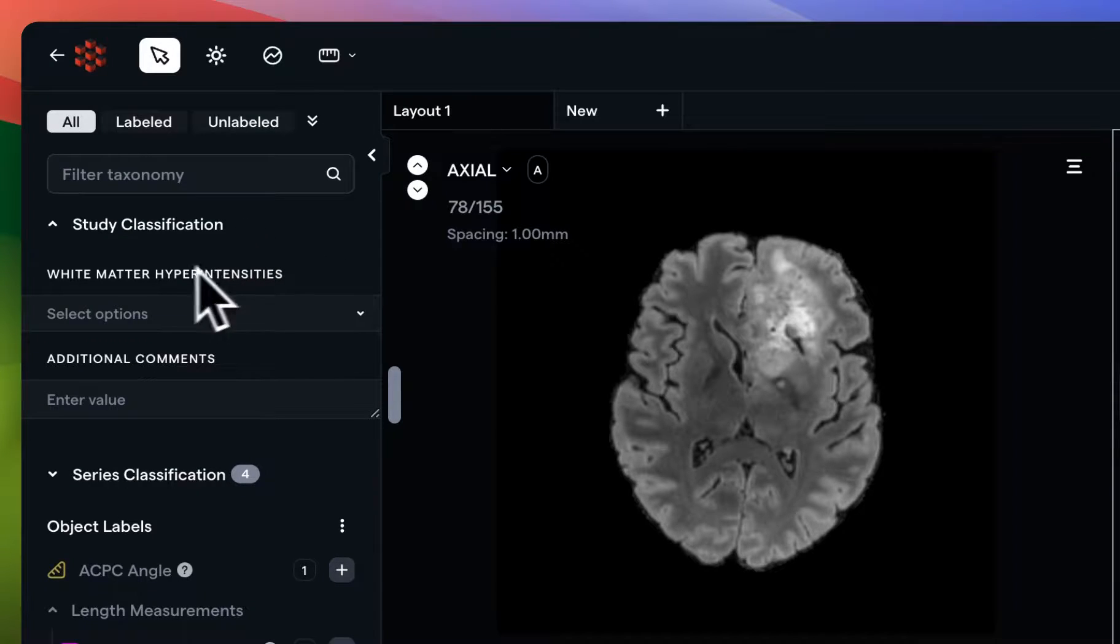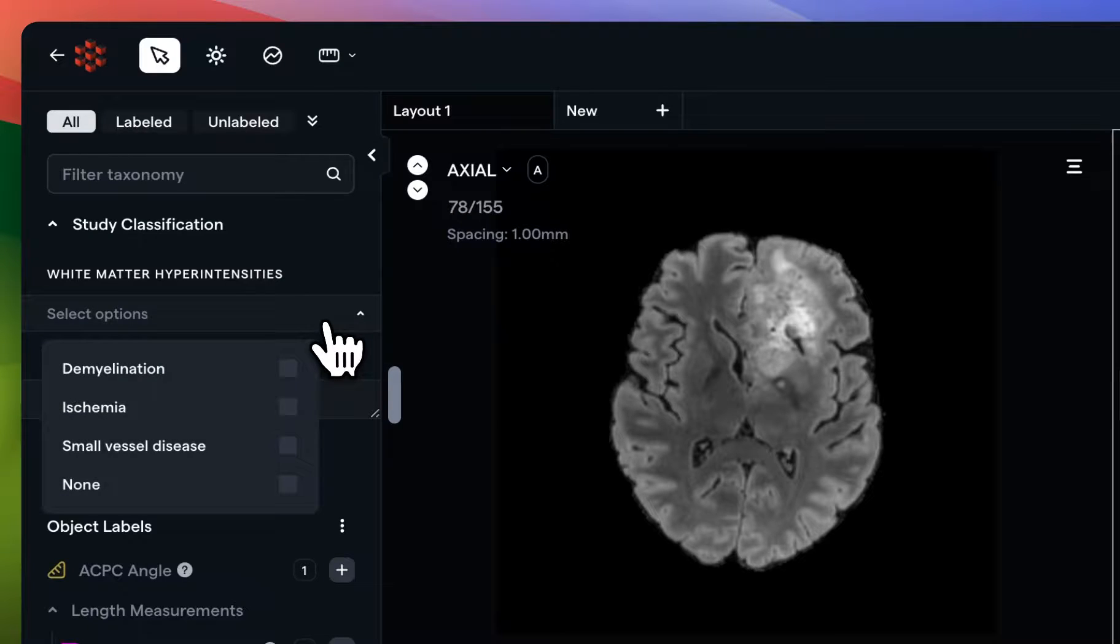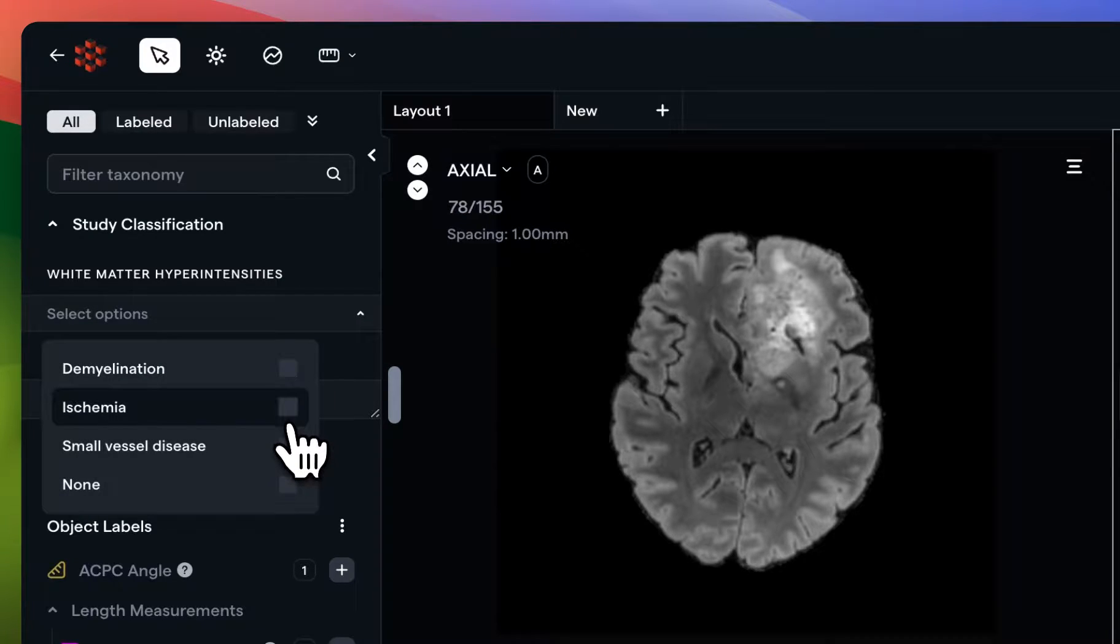The same attribute types can also be applied to a study. In this case, we have white matter hyperintensities. So I'm simply going to choose one, and make sure that that data point is available upon export.